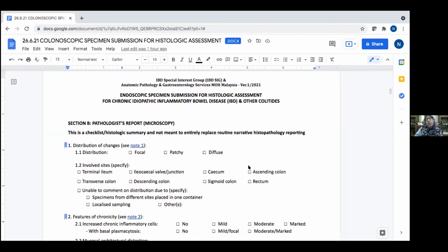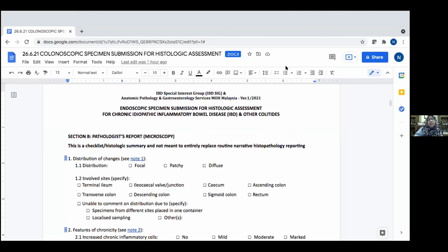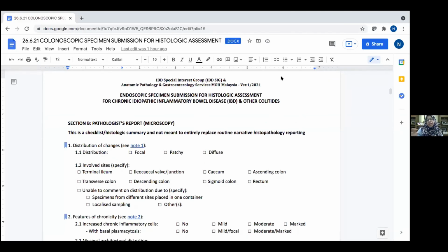No. Eosinophils in the crypt epithelium, a few occasional ones here and there, is normal. If you see nothing else, just a lot of eosinophils in the lamina propria, way beyond 40 per high power field, you may want to make a morphologic diagnosis of mucosal eosinophilia, because the underlying causes for mucosal eosinophilia are a lot.